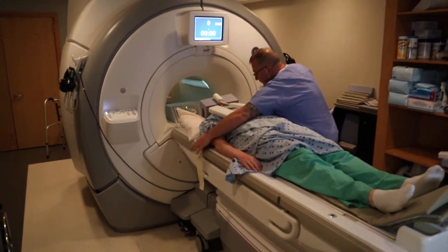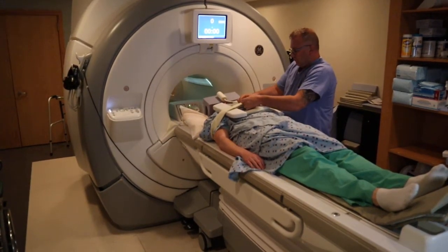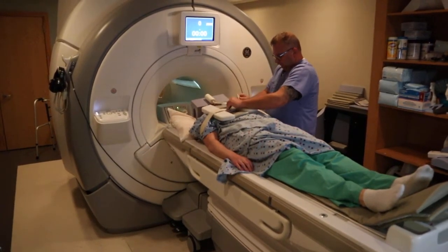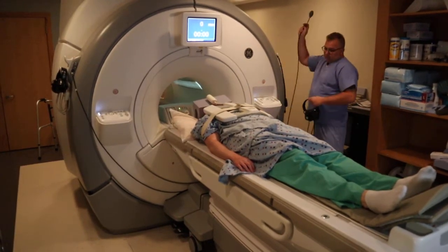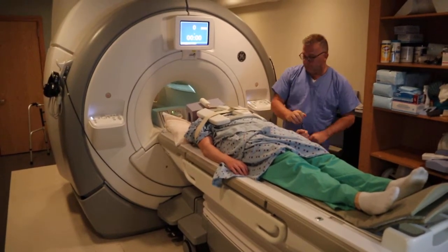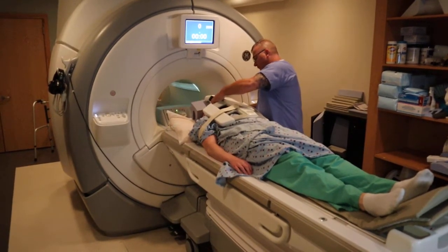You want to ensure that the arms are actually in anatomical position for this study, as the brachial plexus nerve runs from C3 to T2, and you want to cover from humeral head to humeral head. You're going to provide the emergency ball to communicate with the technologist, and a headset to listen to music or communicate with the tech.